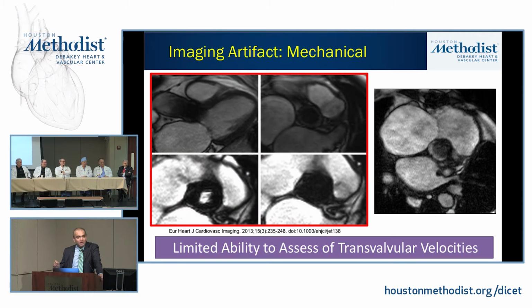The other important thing, obviously, is the artifact. And just like with CT, you get artifact on MR. We're certainly doing things to try to figure out ways to reduce the artifact. But as a result, I think for a mechanical valve, the artifact with MR is going to be pretty significant. Now, it doesn't mean we can't get some general assessment of how, if it's a tilting disc, the leaflets are moving, but I wouldn't really use CMR to try to really quantify motion of a mechanical valve.